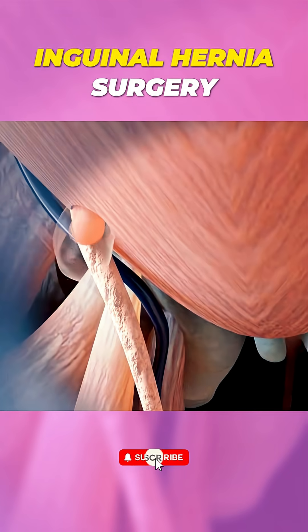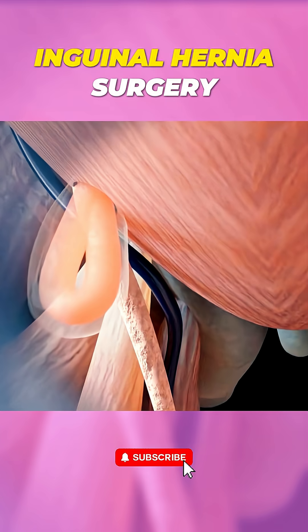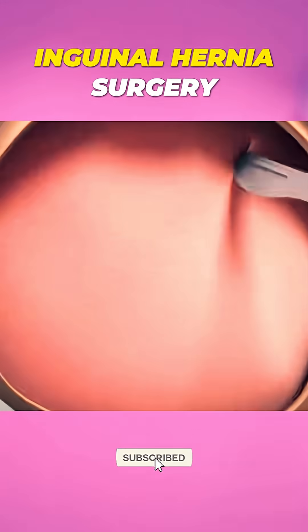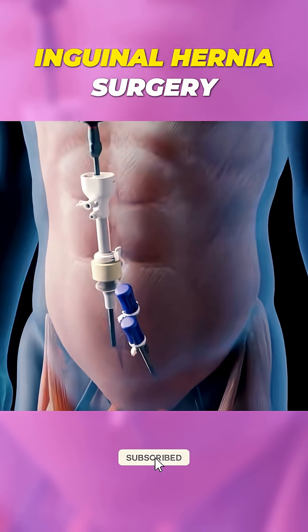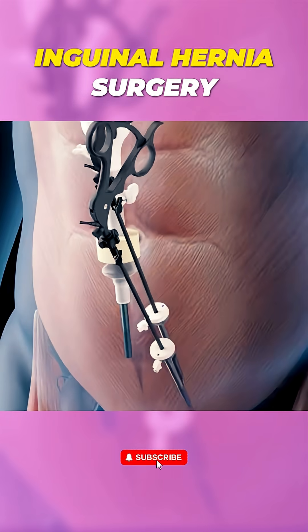Ever wondered how inguinal hernia surgery is done? Let's break it down. Inguinal hernia surgery can be performed either through open surgery or laparoscopic surgery. Here's what happens in each.